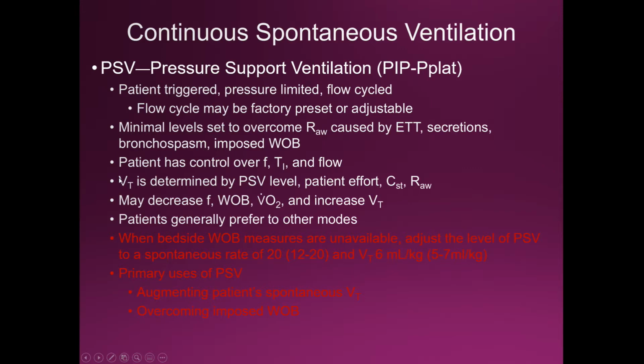Okay, so the difference of your IPAP and EPAP, which is your pressure support in BiPAP mode, will determine your tidal volume. I just want to put that out there because that's what the slide is saying, but we haven't delved into BiPAP so much, so when we do, I'll reiterate this concept later on. Pressure support may decrease respiratory rate, work of breathing, VO2, and increase tidal volume, and that's going to be based on how well you generate tidal volume spontaneously.